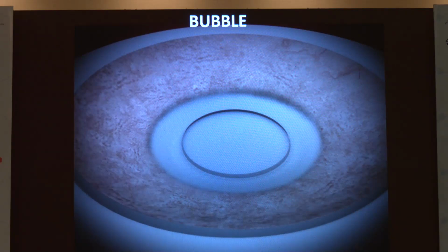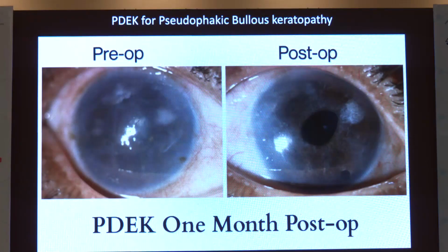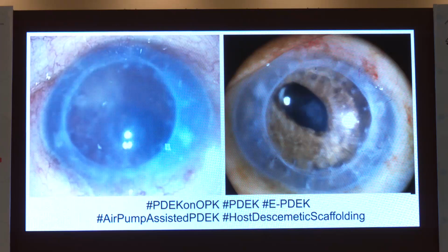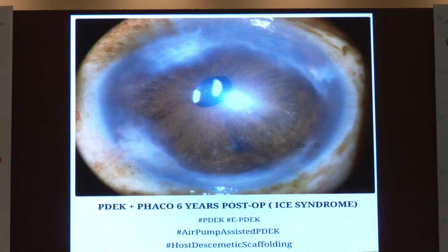And these are just some of our pre and post-op pictures. We do PDEK in almost all cases, even if it is an ACIOL explantation with a glued SFIOL, and post keratoplasties like a failed PK or a TPK, we still go ahead and do PDEK if there's not too much scarring.